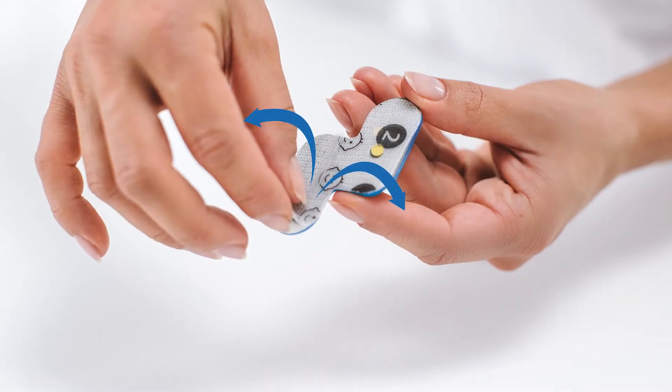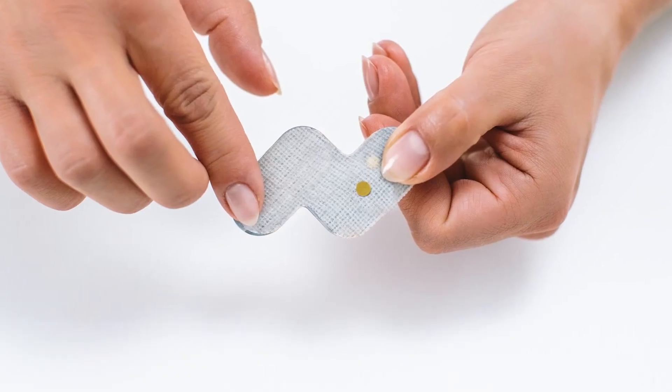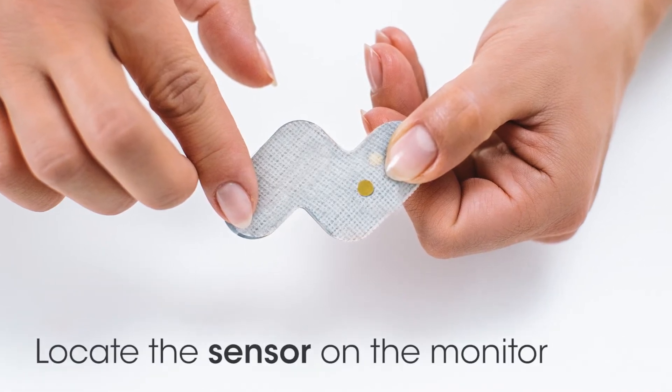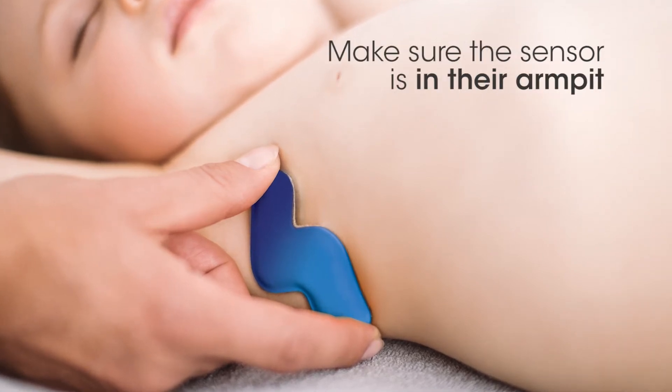The other side of the adhesive has a backing labeled 2. Remove both pieces of this backing. You're now ready to apply the monitor to your child. First, locate the metal sensor on the monitor. Stick the monitor under your child's arm.